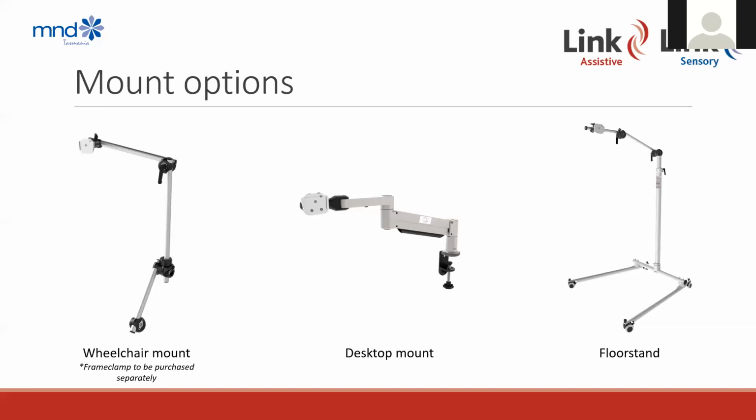This is the option that we recommend for people spending a lot of time in recliner chairs or in bed. And you can use the floor stand moving between recliner and bed as well. So if someone's spending a lot of time at home in those sorts of positions, then a floor stand is going to be the best option for them.